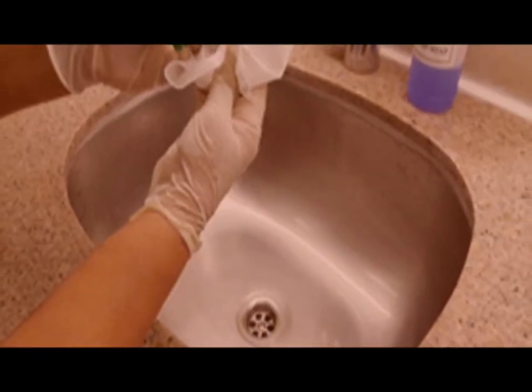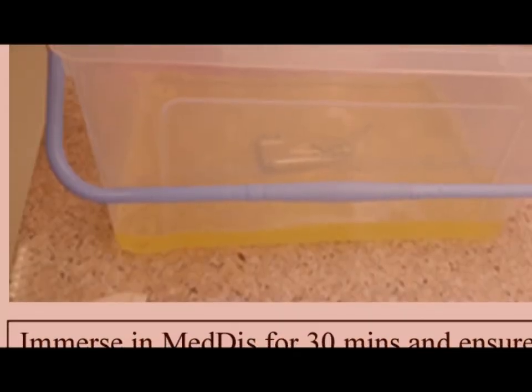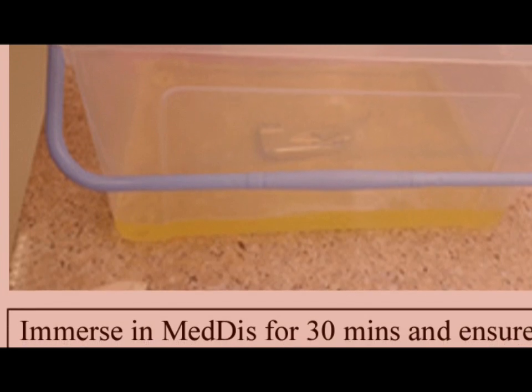Now dry the laryngeal blade with tissue paper. It's time to dip the laryngeal blade into MedDis for 30 minutes.